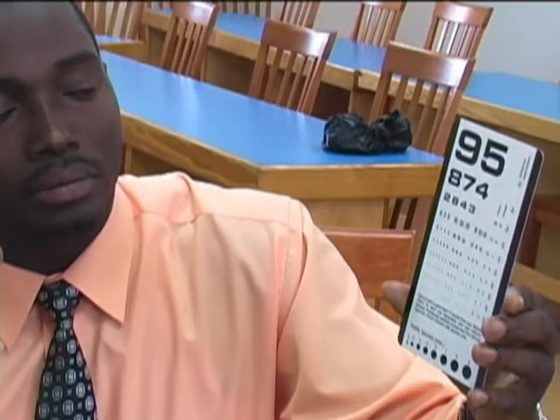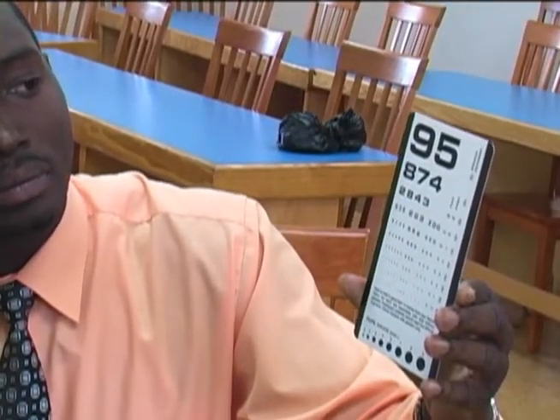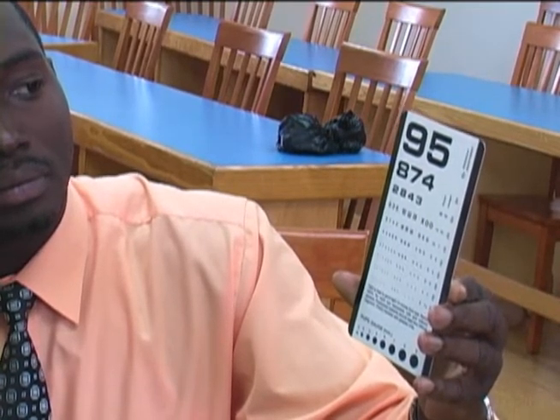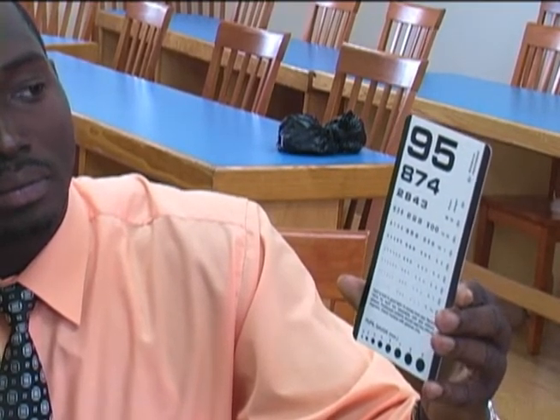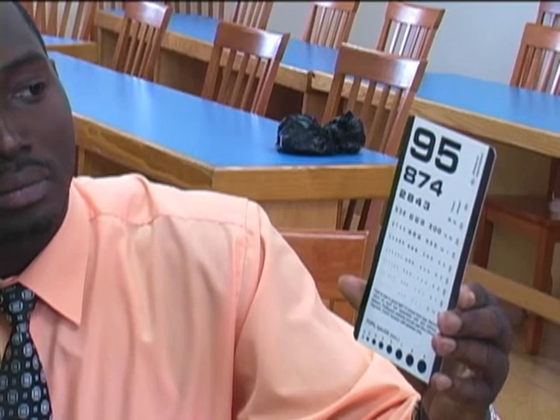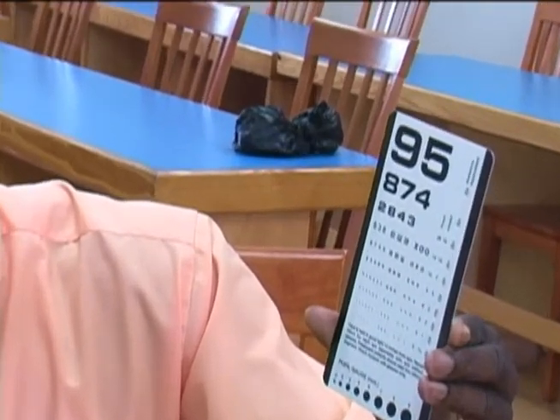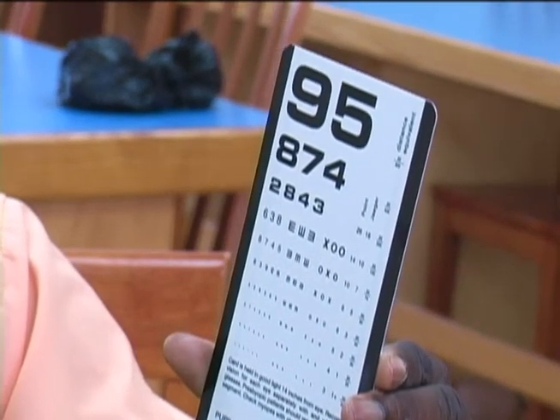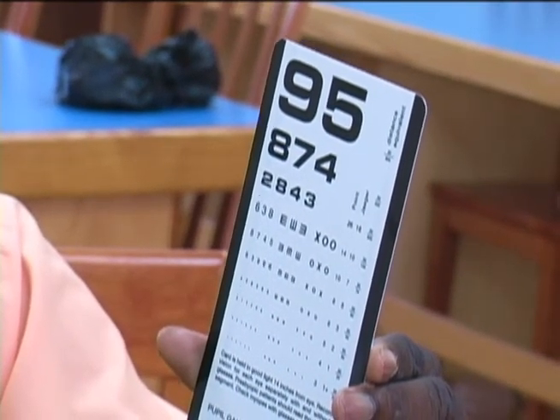We will now perform visual acuity, better defined as central visual acuity. In the laboratory, we will measure visual acuity using the Snellen chart. However, for this demonstration, we are going to use the Rosenbaum chart. Please remember, in the Snellen chart, you stand 20 feet away. In the Rosenbaum, the chart is 14 inches away from the person.